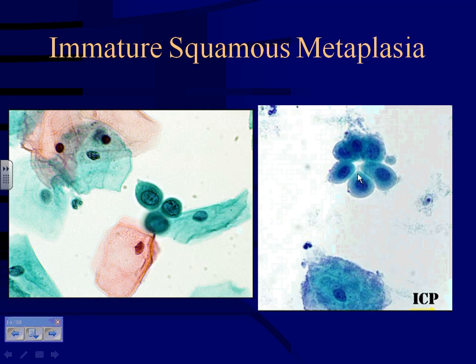And here's another example, different stain, and again, comparing these, and we saw this earlier as well, compare these to your size reference, your intermediate squamous cell, and you see these nuclei are definitely bigger. Remember, these are 50 square microns, these are 35 square microns. And these cells are looking round to slightly polygonal. They're a little looser. They have denser basophilia to their cytoplasm. So again, reflecting that they're starting to have keratinization. And it's an immature, an early keratinization, but it's starting to happen.